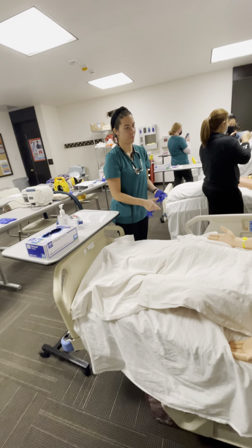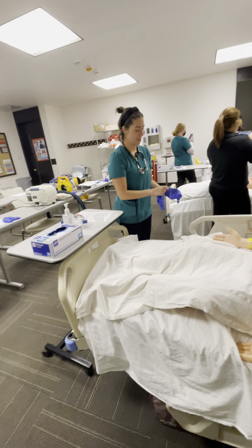Hello, Mr. Street. My name is Felicia. I'll be your respiratory therapist this evening. May I have your name and date of birth?